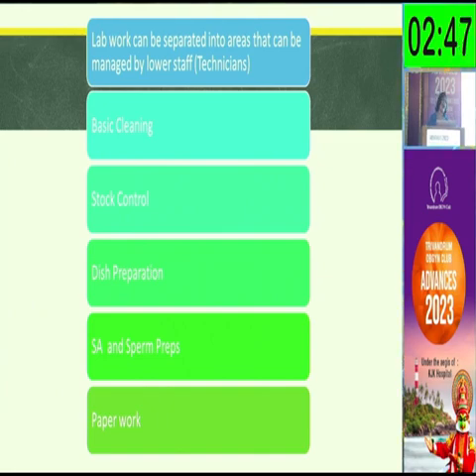And if you find an error later, such as your pregnancy rate has been low, you have something to go back to and check where there has been a mistake. When you don't have anything on paper or anything on the system, how will you go back and check where things could have gone wrong? It is important, and now we know, especially by the ART law, the QC is very important.